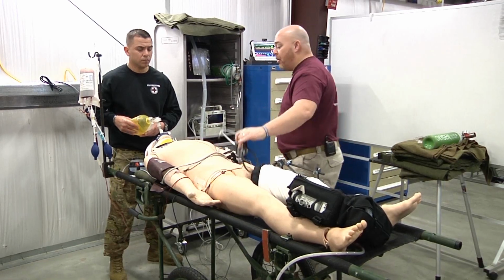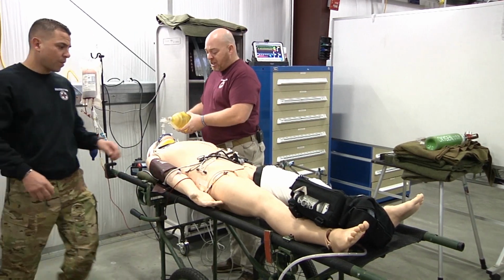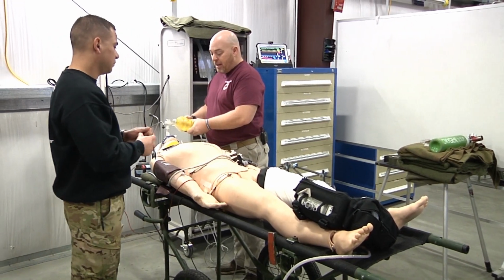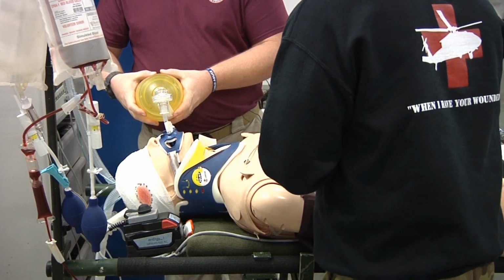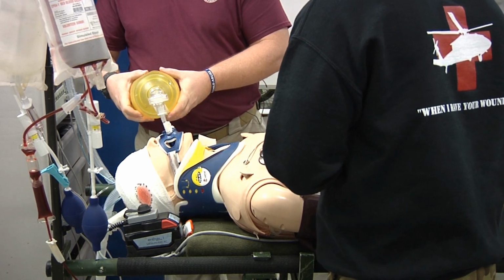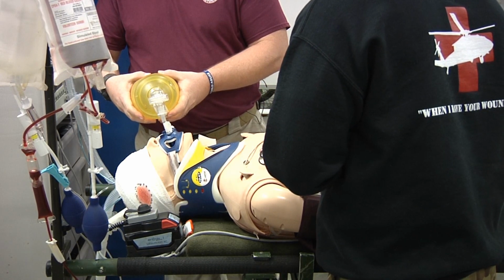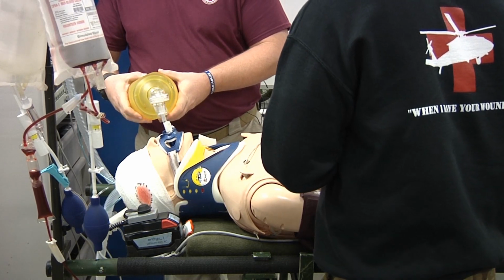After I have done that, my partner and I are going to swap. I'm going to take over bagging for the patient. And what I'm doing is I'm checking baseline lung compliance. This BVM right here should always feel the same every time I bag the patient. If it gets taut, I know that I may have an obstruction.